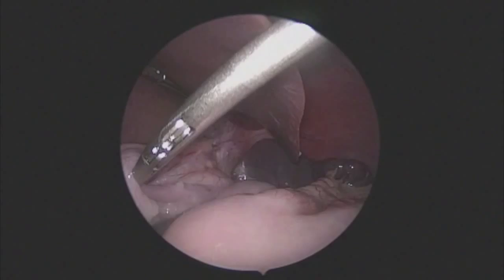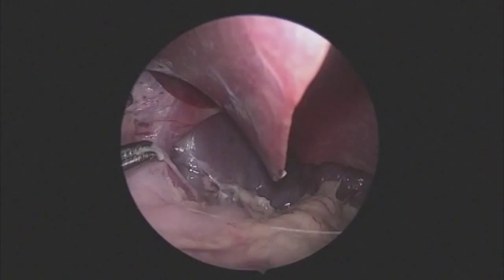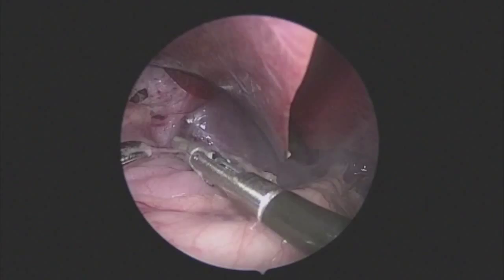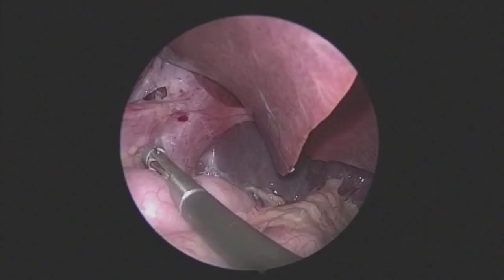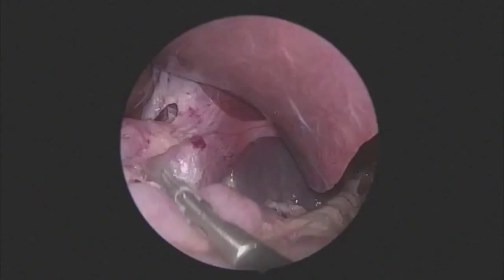Posterior attachments can be addressed by making two to three seals and then tearing the tissue — this technique can also be used safely with the short gastrics. It is also important to dissect down and identify the posterior gastric vessel. This vessel can often tether the stomach and create tension on the wrap, which could cause dysphagia. Here, two seals are made and then the vessel is gently pulled apart rather than cut.